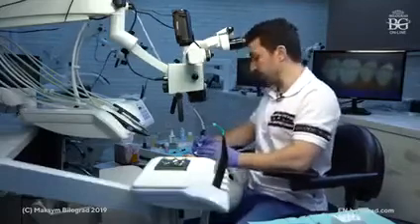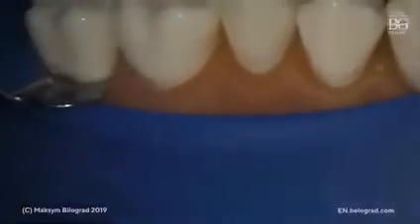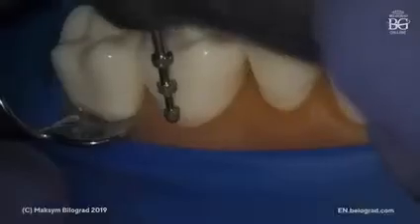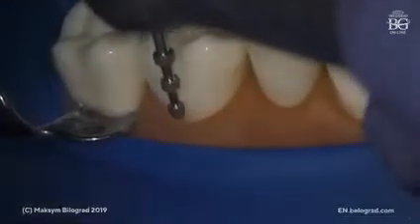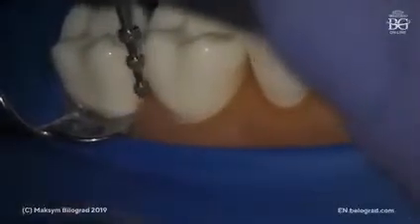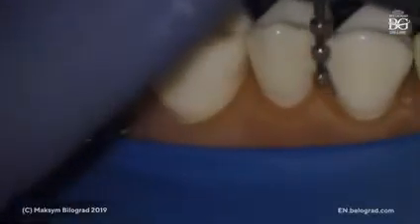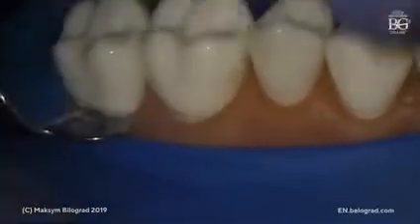Okay, so let me just start preparing. I'm using my depth cutter for the buccal surface. You see that the tooth is pretty short, so I cannot use these 3 active elements. We can use just 2 of them on the molar, and on this premolar also. Maybe for this premolar I'll be able to prep with 3 active elements.